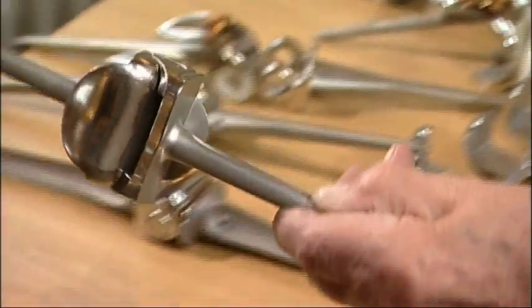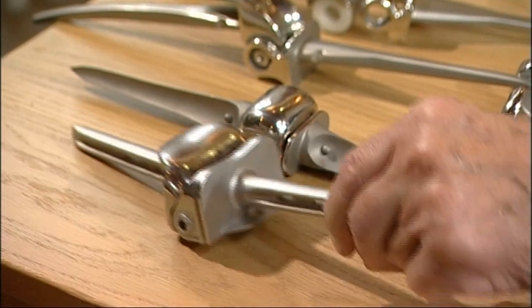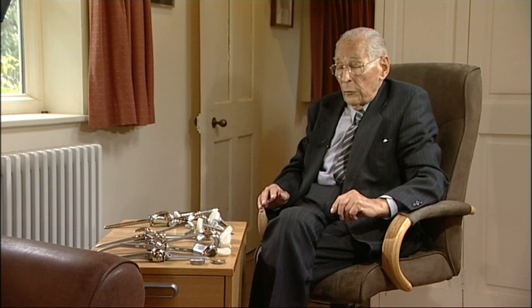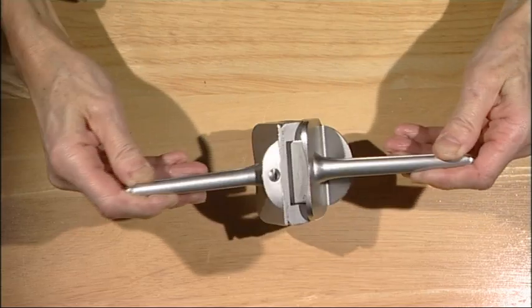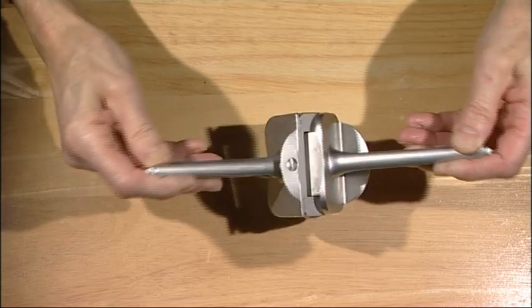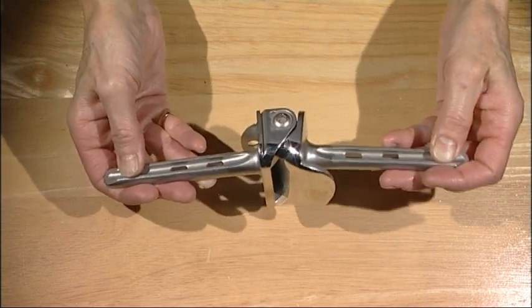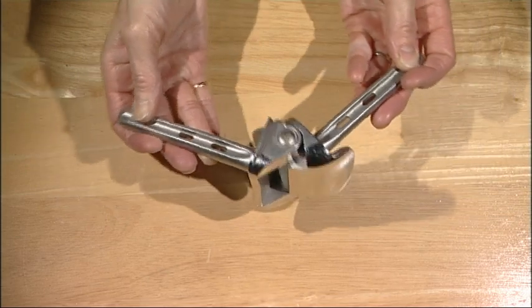The results from this were acceptable in that people could walk with this joint, largely in an extended position. They could also sit with relative comfort. It didn't allow a movement of more than 90 degrees, but that appeared to be adequate for ordinary practical purposes. The Waldius implants lasted well because the stems were not cemented. They were free to move within the shafts of the tibia and femur to accommodate rotation at the knee.